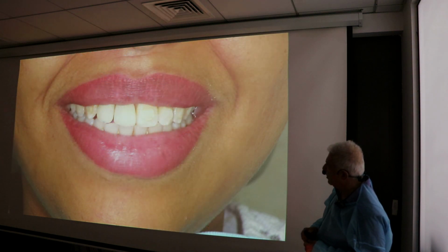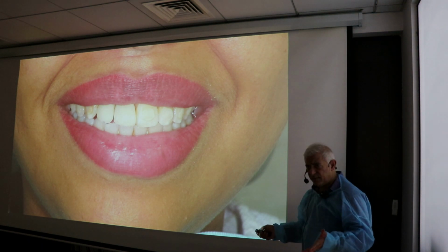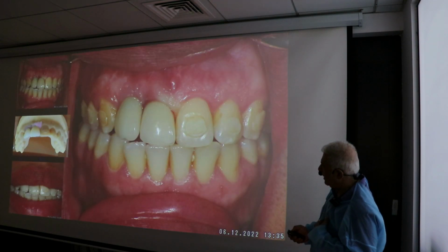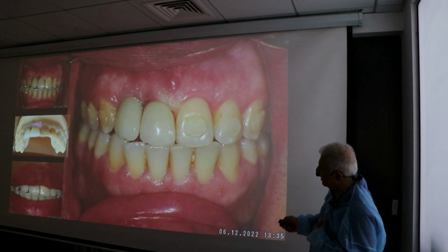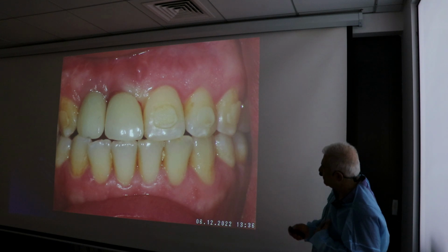So from here, we took her to this. For the photograph, it's fine, but clinically, it's not fine. From that to this, I know I still have a little room if I want to play with the gum, but this is my problem that I cannot achieve.